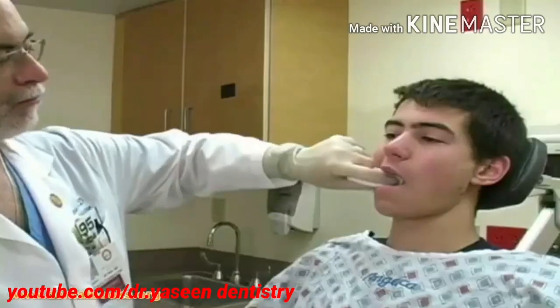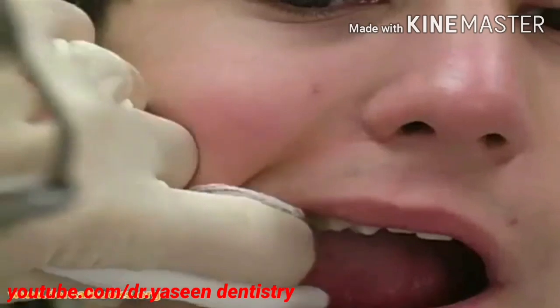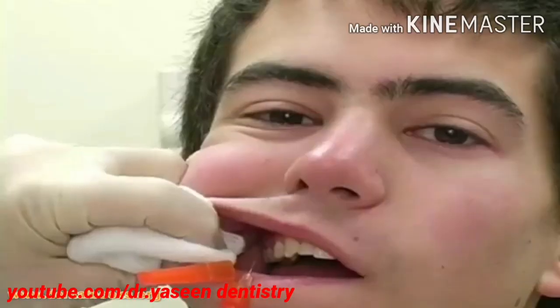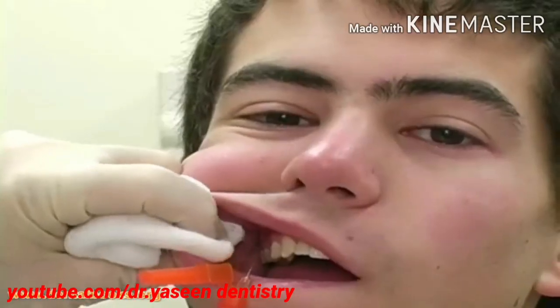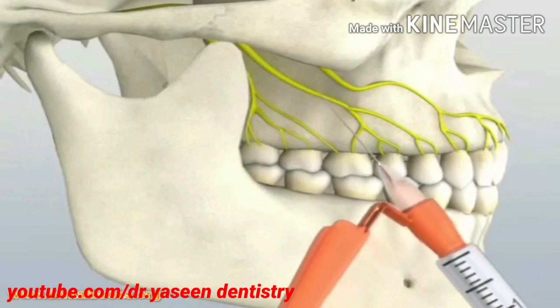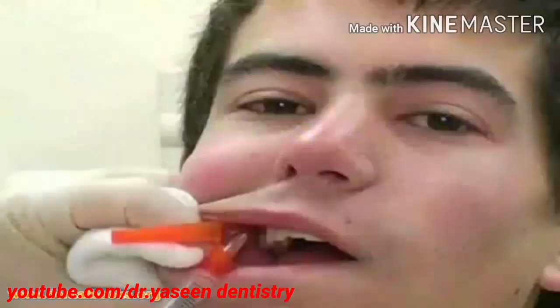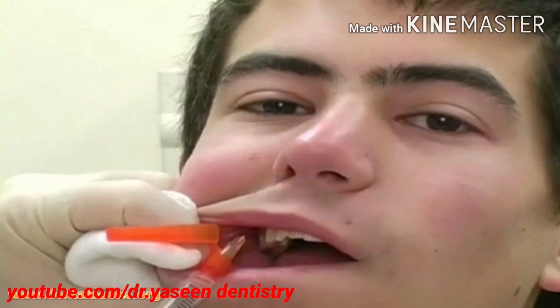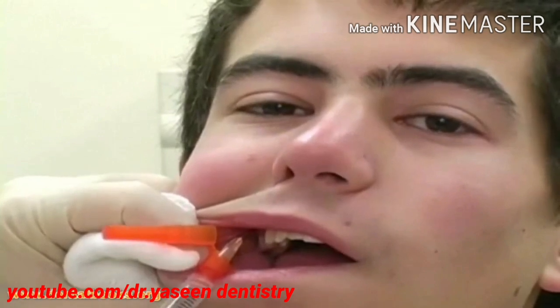Position the patient's mouth half open with the jaw swung toward you and use a piece of gauze to retract the cheek laterally. Insert a 3.5 centimeter, 25 gauge needle through the buccal mucosa between the second premolar and the first molar and direct it at a 45-degree angle. Aspirate to exclude intravascular placement and then inject 2 to 3 milliliters of anesthetic.